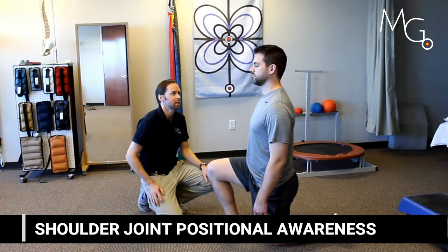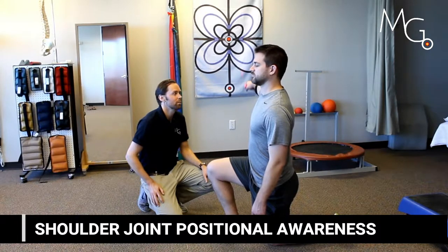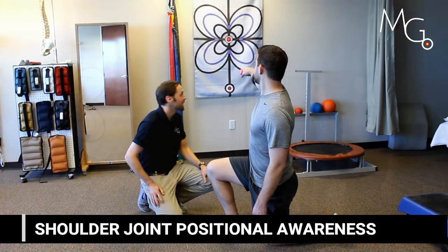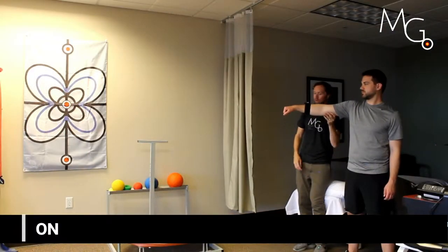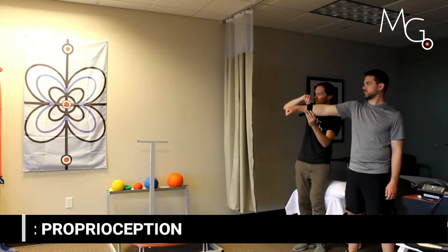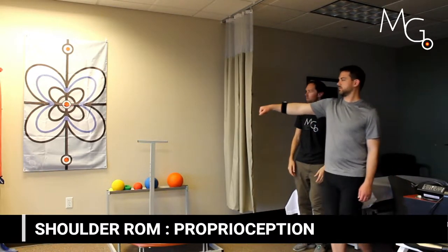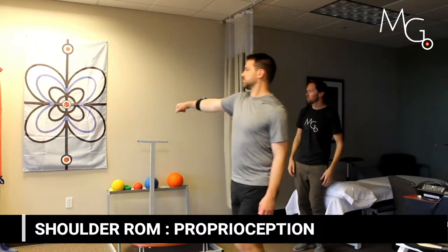Research shows that patients with shoulder instabilities have an inherent deficit to their joint positional awareness — and you can train this. You can also get creative with joint proprioception, such as having the patient hold the laser on target while completing a task such as walking.